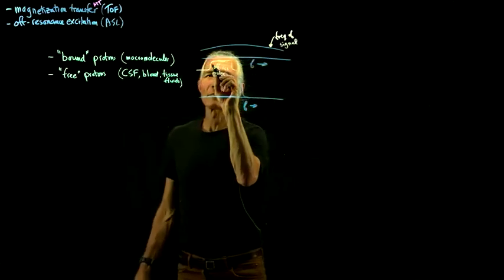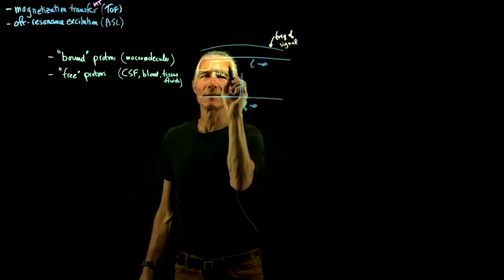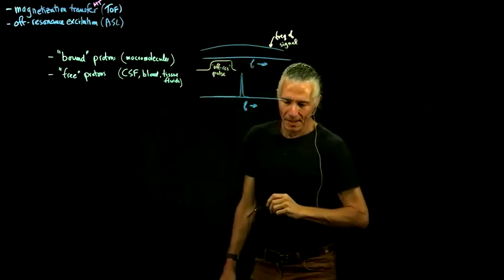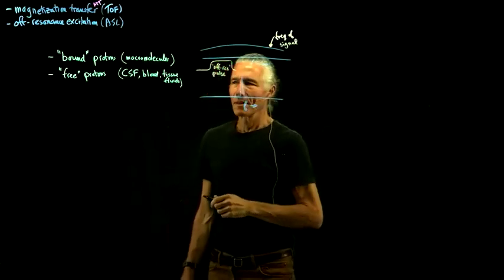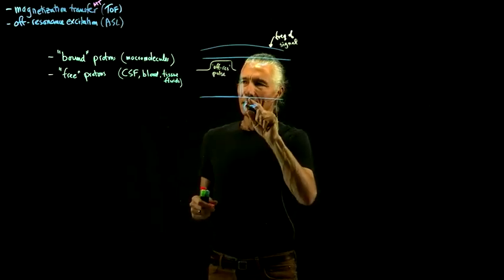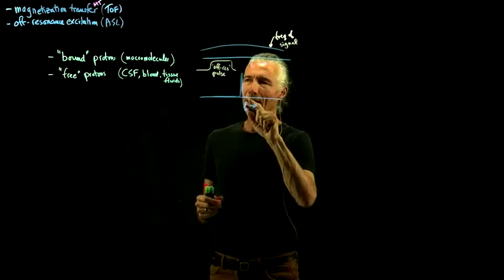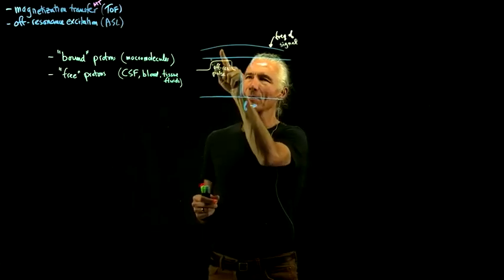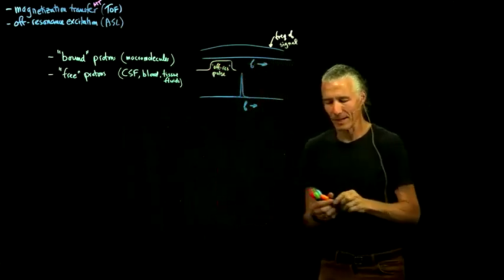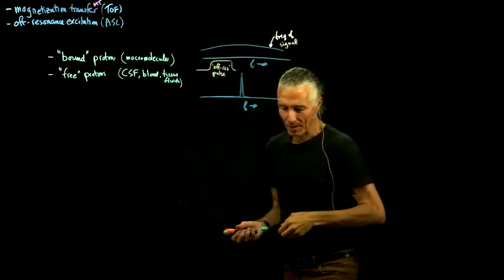So to put that in quotes, it's really on resonance for the macromolecules. If you do that, then you can eventually look at the signal, which is going to be bigger, coming from the water, and look at how that off-resonance pulse, which excited these guys, affected the water signal. And that's the transfer, the magnetization transfer part.